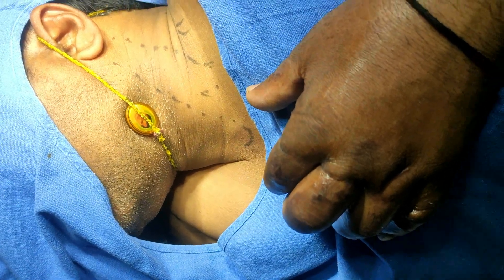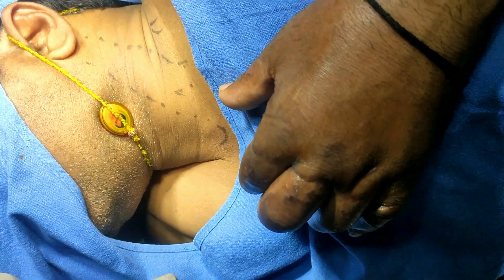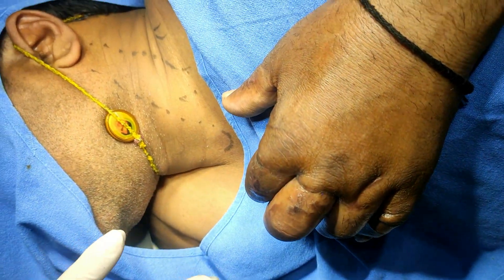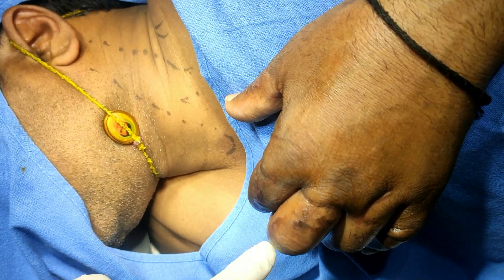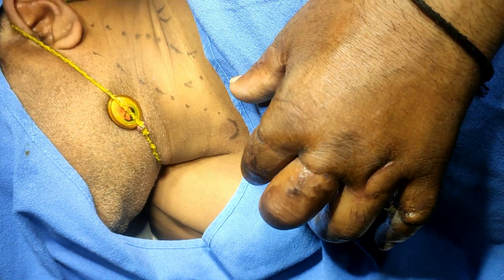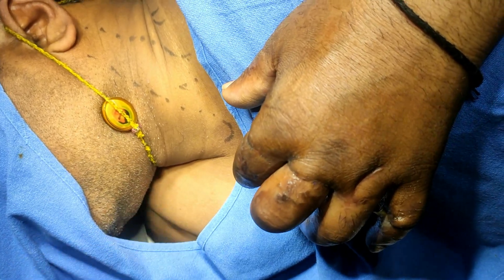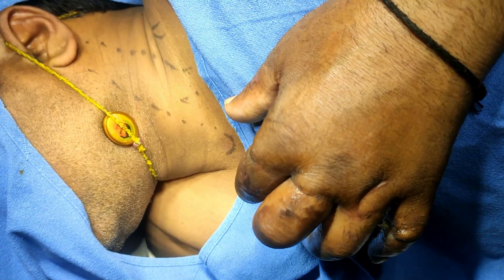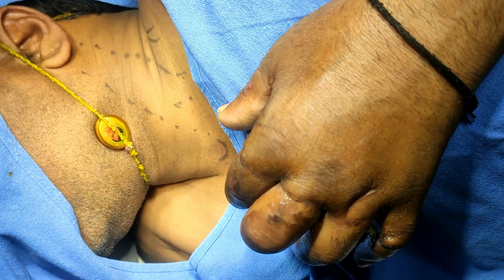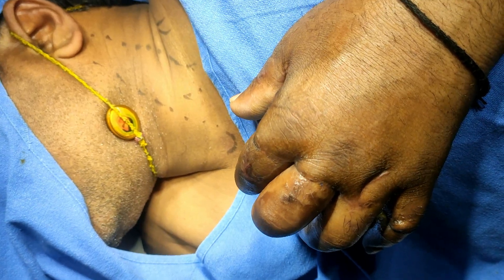In the case of accidental near-total amputation of all four fingers of the left hand, you can notice there is a lot of edema and little movement of the middle, ring finger. Here I am giving a brachial block that also combines the sympathetic block of the upper limb. This is to minimize edema and whatever CRPS type 1 is involved in this hand — it will minimize the edema and also make the hand a little soft and supple.